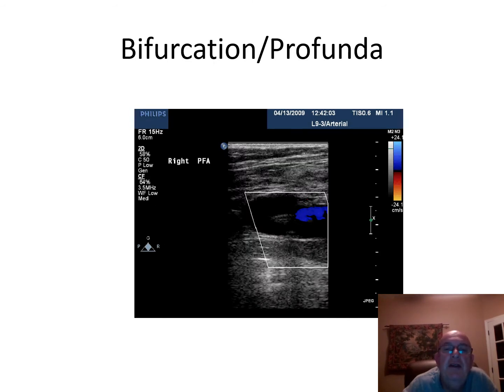This is at the area of the distal common femoral where it bifurcates into the profunda and the proximal superficial femoral artery. Very nice representation here of watching the vessel bifurcate. You can see the normal venous flow pattern that occurs between, as we will discuss later in venous, but you can hear it now. All deep veins and arteries travel together. So this is really going to be the femoral vein sitting next to the femoral artery at the proximal origin. You would see the same if we'd focus here, but this is primarily to demonstrate the bifurcation profunda femoris.